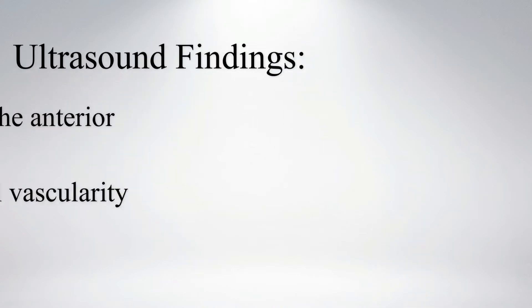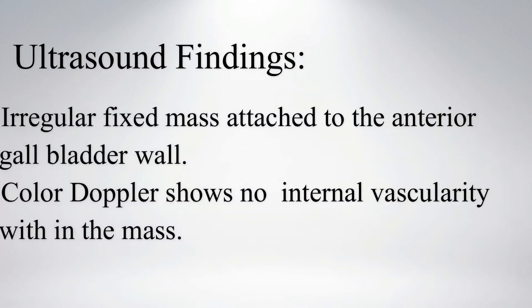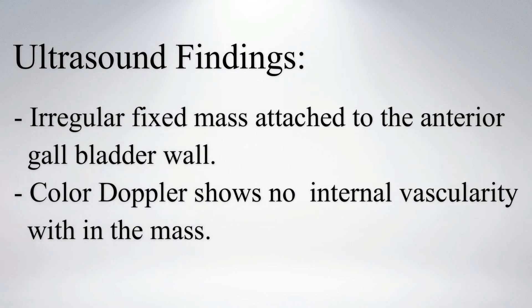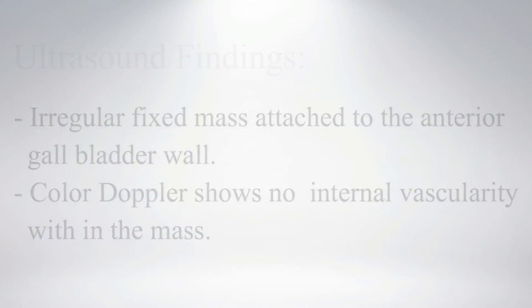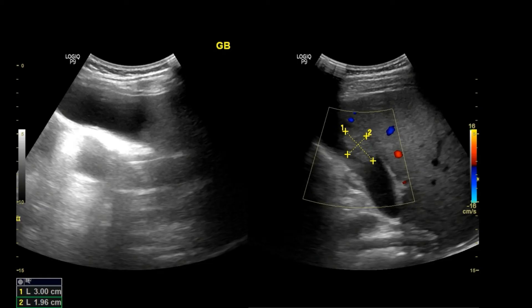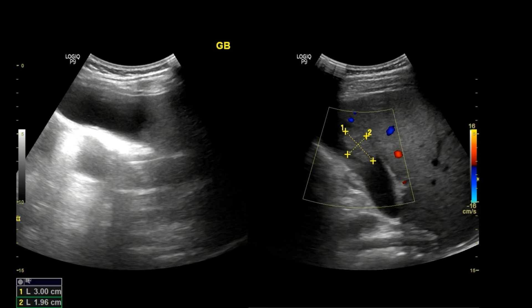On ultrasound, an irregular fixed mass adjacent to the anterior gallbladder wall is noted. Color Doppler shows no definite internal vascularity within the mass. This image shows an irregular oval mass attached to the anterior gallbladder wall.